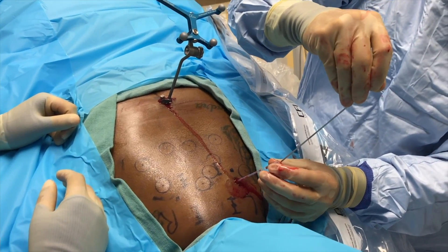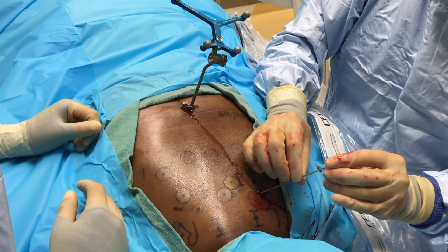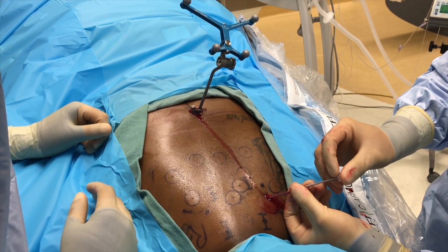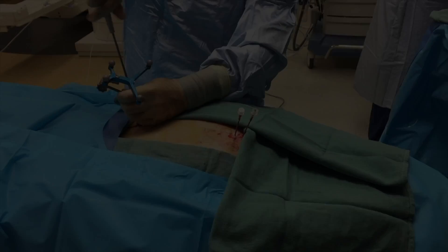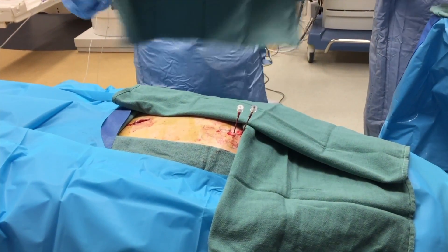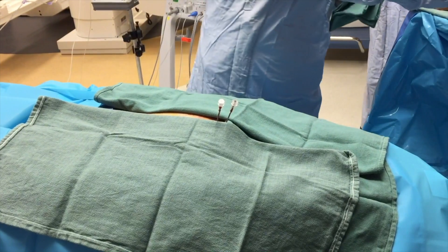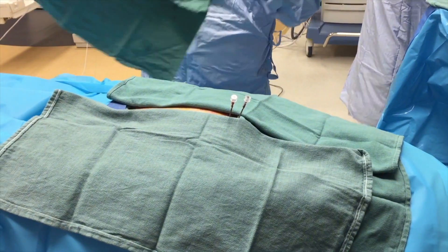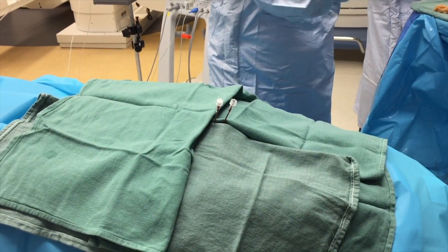A titanium trocar is then inserted. This process is then repeated in sequence, depending on the number of laser fibers planned. The navigation array and spinous process clamp are subsequently removed, and the incision is packed, though it is not closed in the event that it is needed later. The protruding cannula are draped in a sterile fashion, and fenestrated MRI coils are placed.